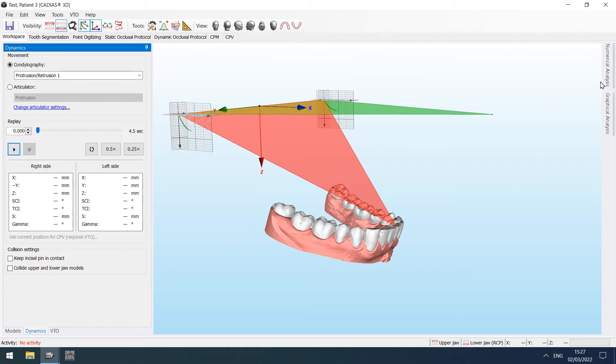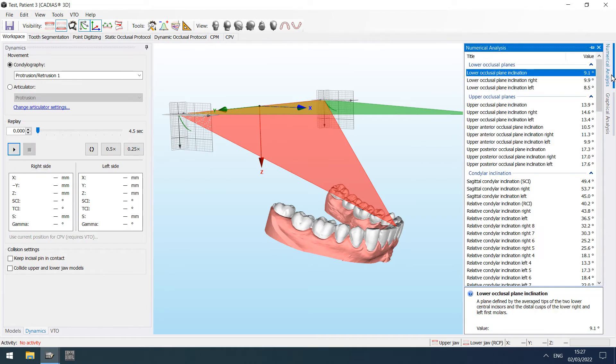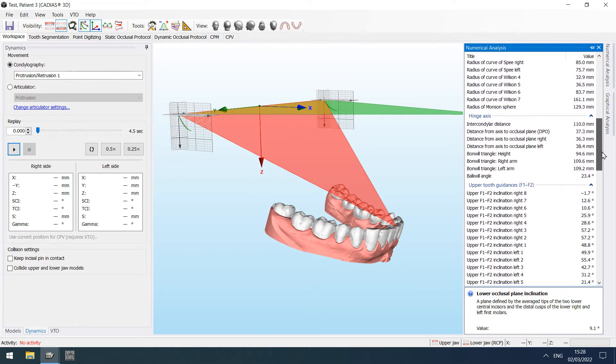Corresponding numeric parameters for the Bonwill triangle can now also be found in the numerical analysis.